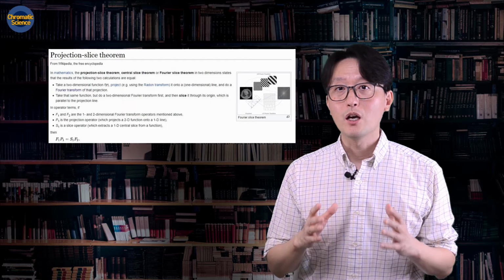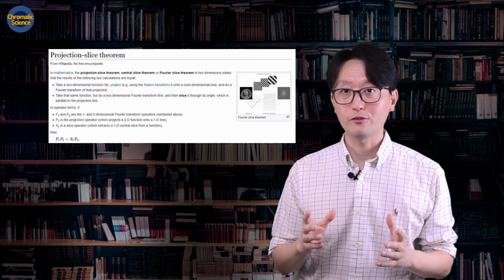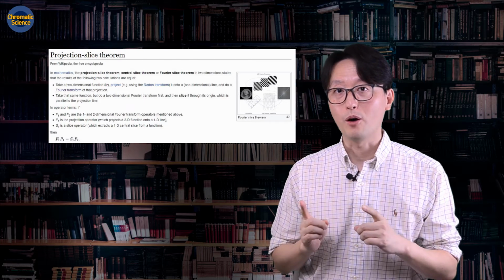In engineering, we have a very famous tool which is called the Fourier Transform. The slice theorem is based on the Fourier Transform. Using the Fourier Transform, you can change signals or general information into a different form. We actually use the Fourier Transform many times.